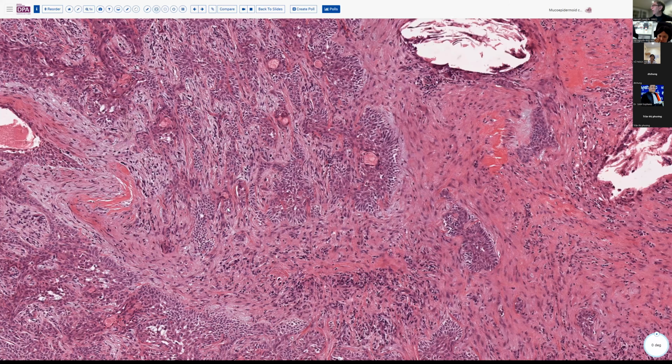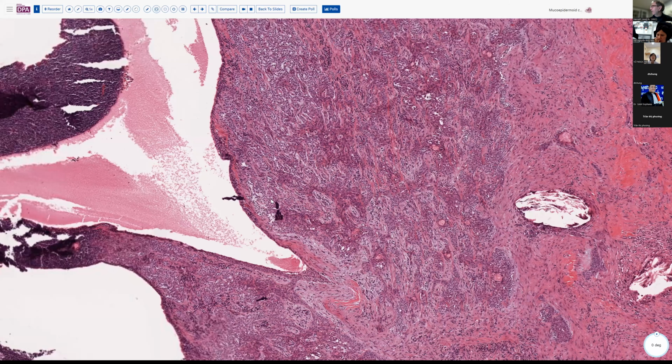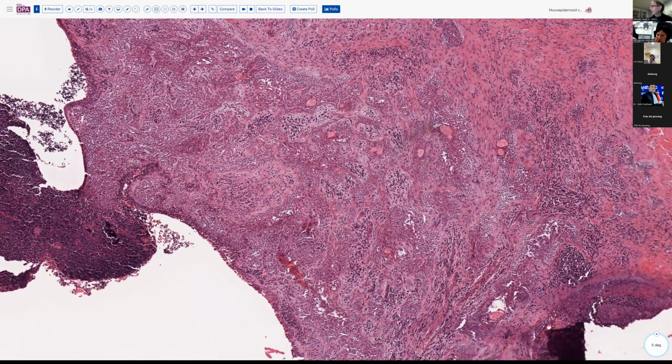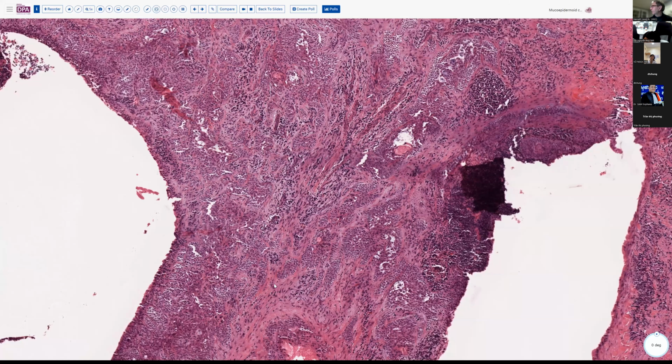And so this is a case where, you know, there are relatively rare mucoid elements, and you might have to stain several slides to look for those elements. And even finding a couple is probably adequate to be able to classify it, particularly in the higher grade tumors like this is. Finding just a rare cell that has a little bit of a mucoid cytoplasm should be adequate to make the diagnosis.